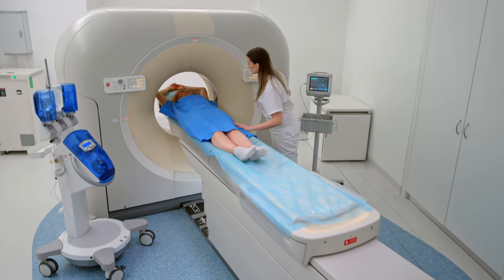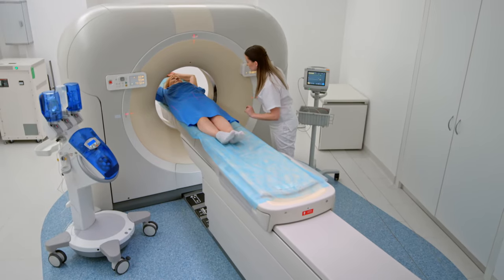The CT scan takes pictures of your heart in between your heartbeats when your heart is still. If your heart is beating too fast, we may need to give a short-acting beta blocker that works very quickly to slow down your heart. They are selective so they mostly work on your heart, and most people don't feel anything when the beta blocker is given.